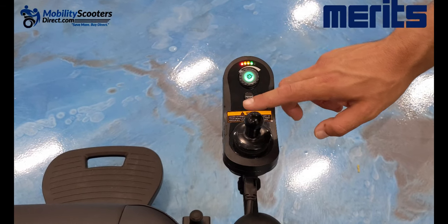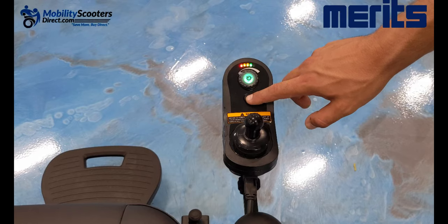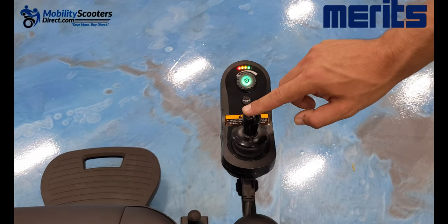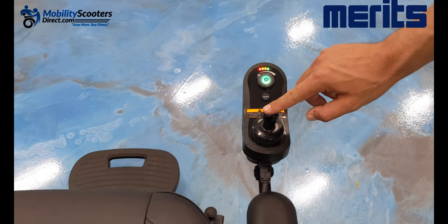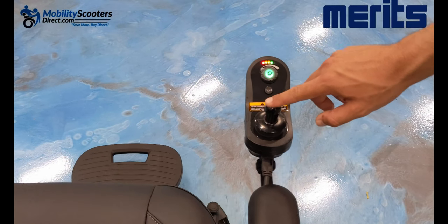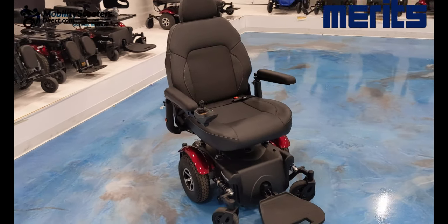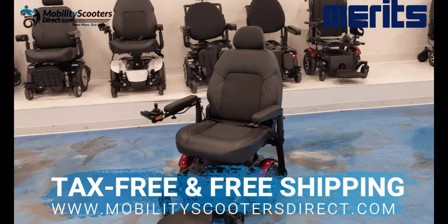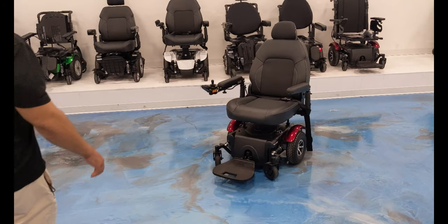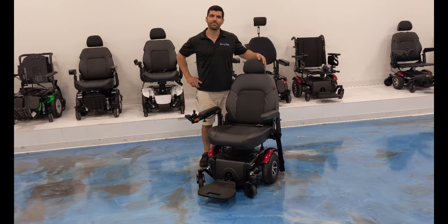The chair does have a horn, which is pretty loud, and the joystick works just like any other power wheelchair joystick. It takes a little getting used to if you haven't used one before — turning left and right rotates the chair, and forward and back moves it forward and back. All in all, we highly recommend this power wheelchair. It has full suspension and many custom options, and it's tax-free with free shipping at mobilityscootersdirect.com. Thank you so much for watching, have a great day.